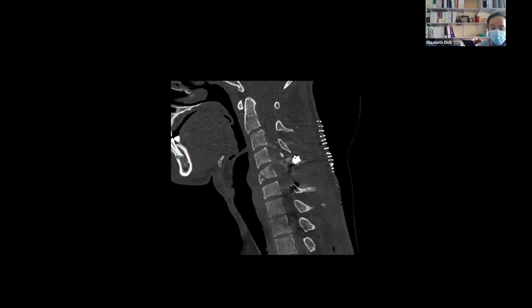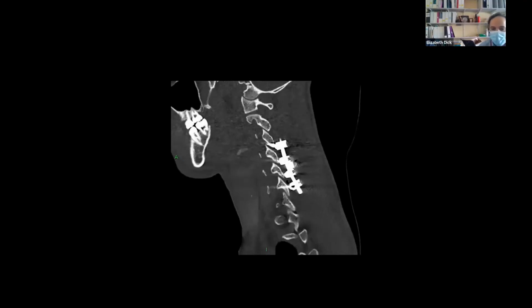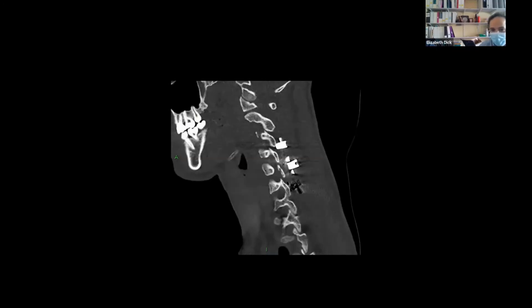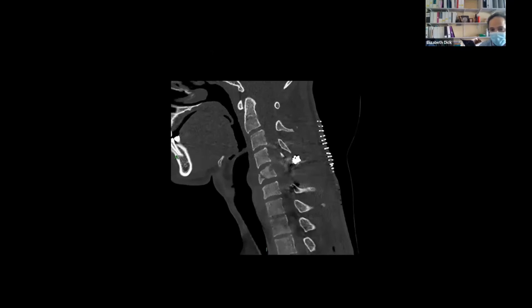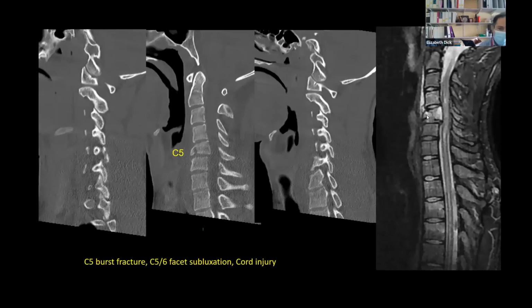At the time the surgeon decided to proceed with an operation as soon as possible, given the injury and the instability. What you've got is a burst fracture of the C5 vertebra, but there's been some retropulsion, and the MRI shows definite cord contusion. You can see exactly where the injury is and the retropulsion which has resulted in that. And already you can see the cord at the level above it has been involved as well.